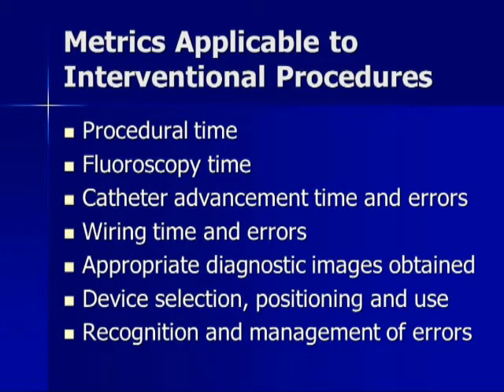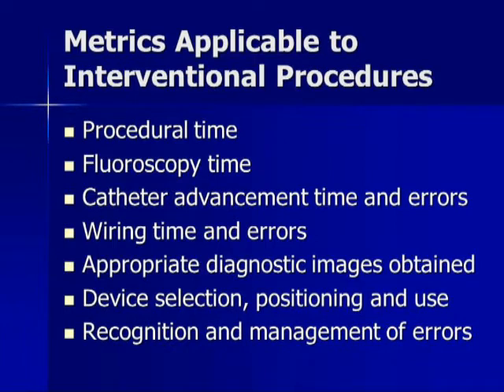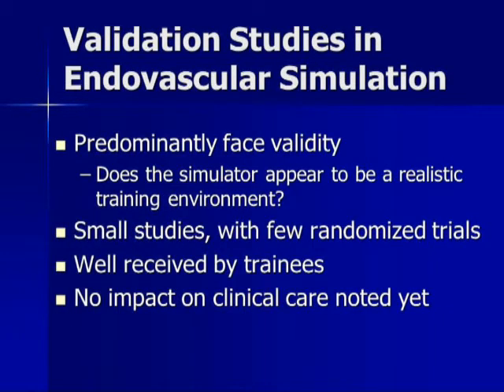I think finally, the thing that is the most useful is the use of simulated adverse events. This is a way we've developed, SAEs as we call them, basically to ensure that everyone gets the same complication such that you can measure their time to response. Did they need a mentor? And when they responded, did they have inappropriate or guideline discordant treatments of those? We've been shocked testing physicians and looking at their outcomes with that.